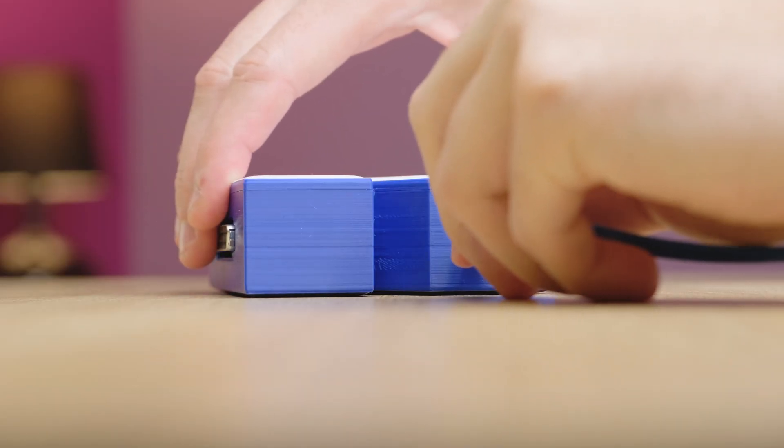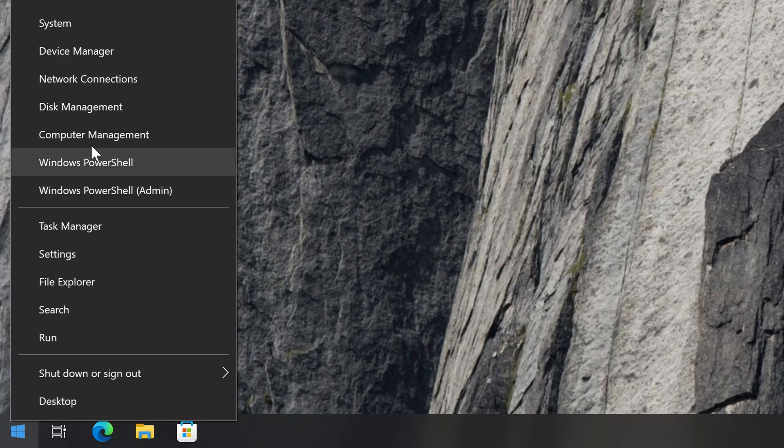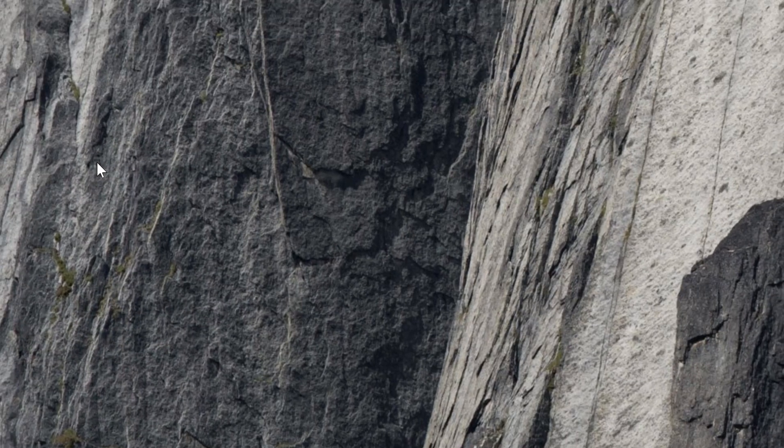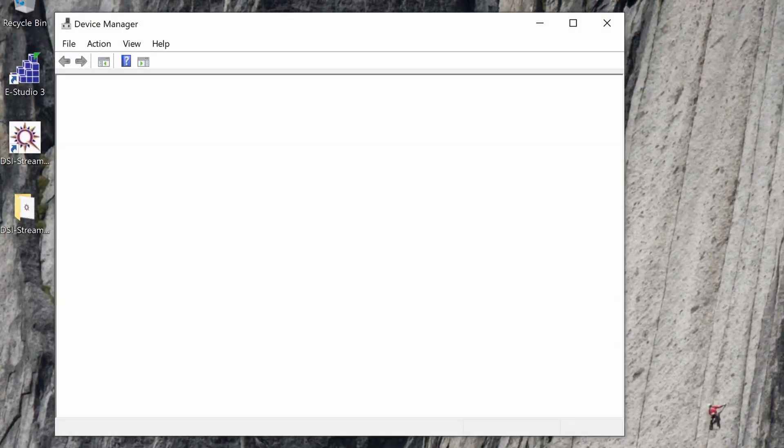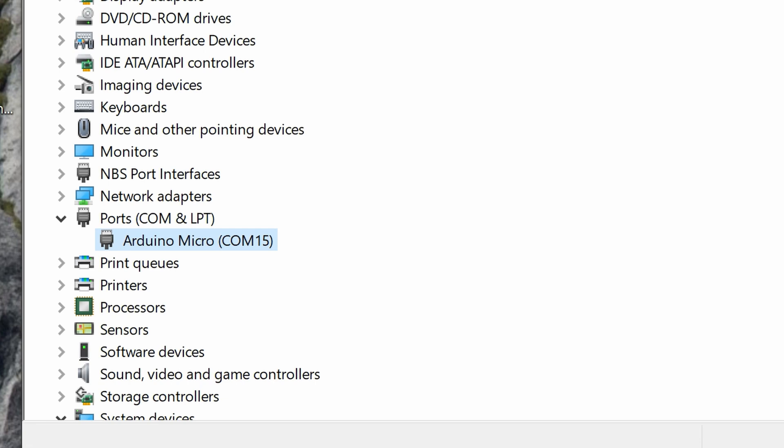First, connect your MBTS via the USB cable to your computer. Then right-click on the Windows Start button and open Device Manager. Next, open the Ports (COM & LPT) section and take note of the COM port number. Now that we've determined the appropriate COM port number, we're ready to connect the MBTS with the DSi.